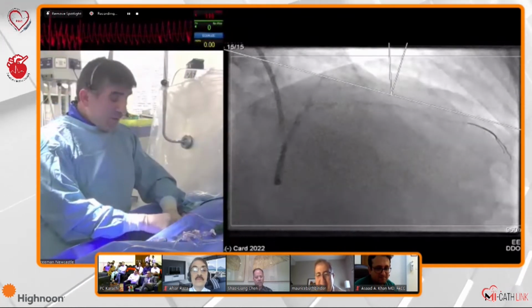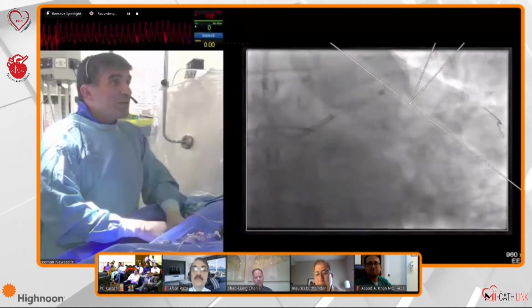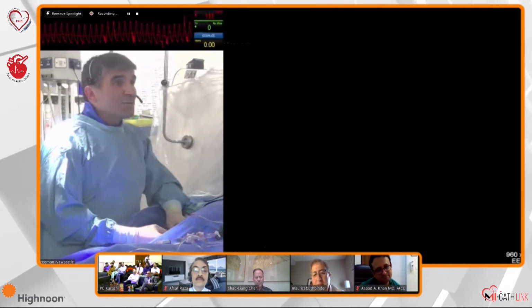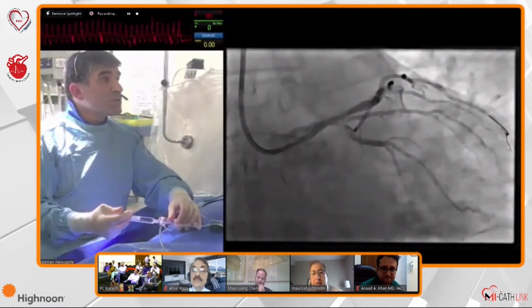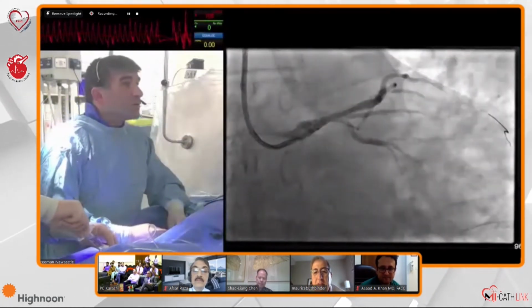There is no chance. I have many examples, particularly with, say, the diagonal or LAD or circ, where you think you've seen the ostium, you go to another view and it's miles away from what you think. So we just have to be careful how we look at the ostium, and this is why we sometimes fear. Using the IVUS could help you quite a lot.